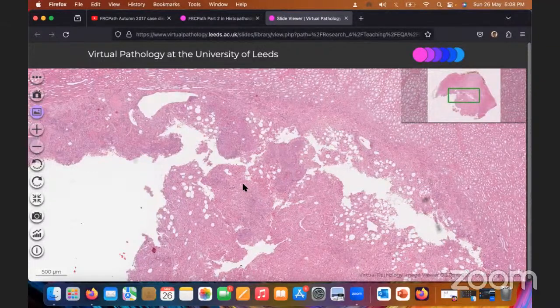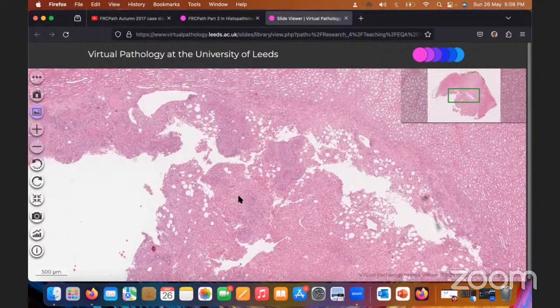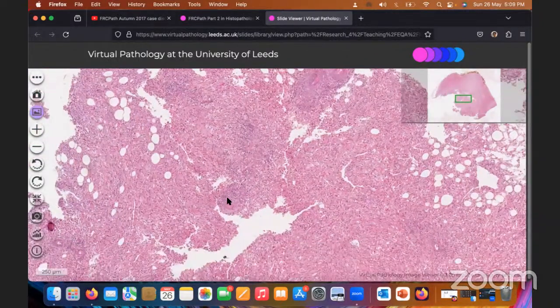In the further workup, apart from further sectioning, you must say that this lesion is known for both smooth muscle phenotype as well as melanocytic phenotype. So markers like HMB45, Melan-A, as well as SMA are positive, and you can mention the SMA is also positive in the mature adipocytic element. You also say you will revisit the gross to denote the centricity or multifocality, because renal angiomyolipoma, if it is multiple, then it has an increased propensity for syndromic association like tuberous sclerosis. So in the further sectioning, further workup, this is how you complete the further workup.